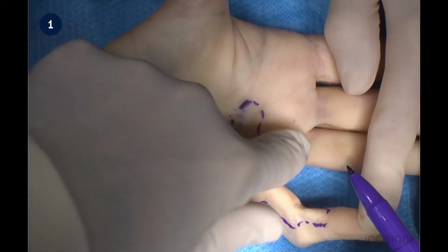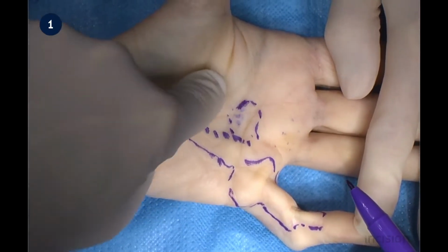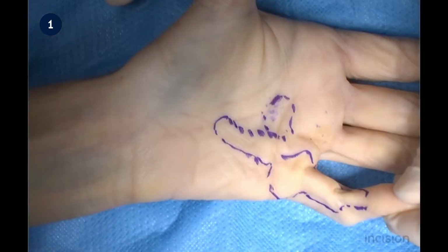The other rays are palpated to identify any diseased tissue in these rays. Note that both the palmar area and the digit itself are affected in the fifth digit, and that only the palmar area is affected in the fourth digit.